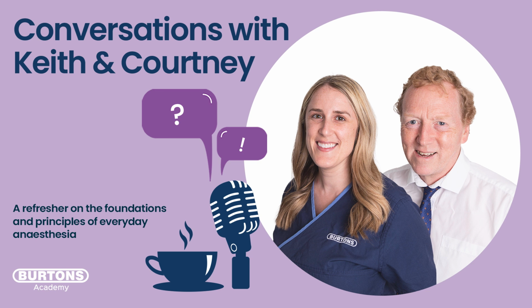And the nice thing about it, compared to the transmission, is it's not the technology, it's the way it's held in place. The transmission has a spring to hold it in place. It slowly compresses the tissue, which exsanguinates it. Well, not exsanguinates it, but it reduces flow. Whereas the reflectance, because it doesn't have that continual pressure, and you just hold it in place with a bit of cotton wool, it just sits there and picks it up and continues to give you a good reading.